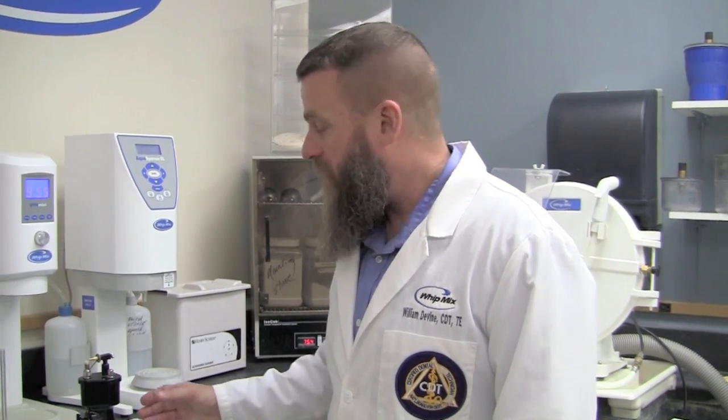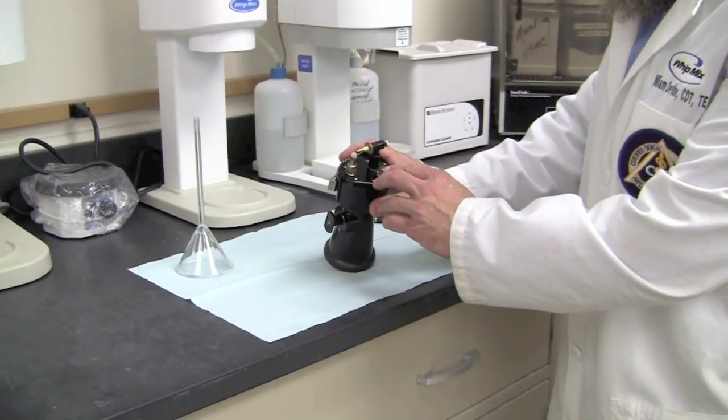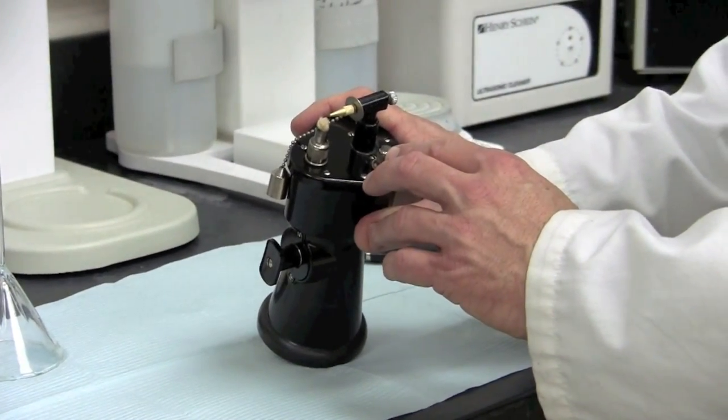Before we light the torch, it's important to allow, through capillary action, alcohol to be absorbed into the wick. We want to make sure it's completely saturated before lighting. Also, we want to inspect the filler cap — make sure that it is not clogged with any wax, because there needs to be air flow.